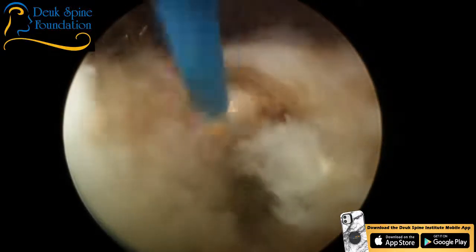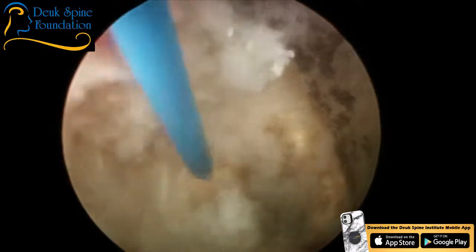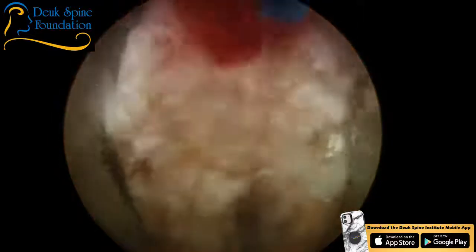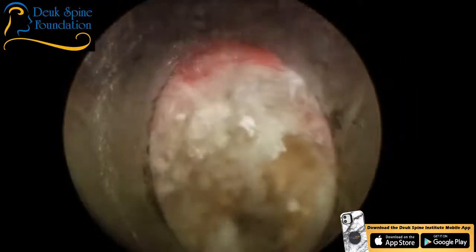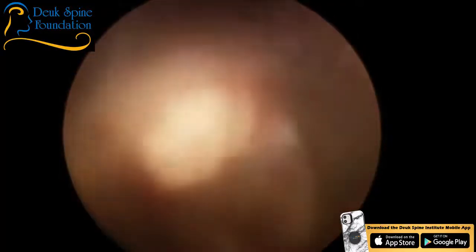This is all chunky scar tissue. It's totally abnormal. You never see it this thick unless it's scar tissue. This is not what a normal disc looks like. A normal disc is soft and billowy. And we could probably even see the nerve root up there. That's the end plate, and I think the nerve root's going to be just above this.